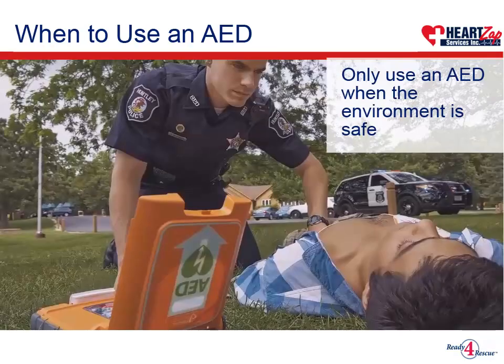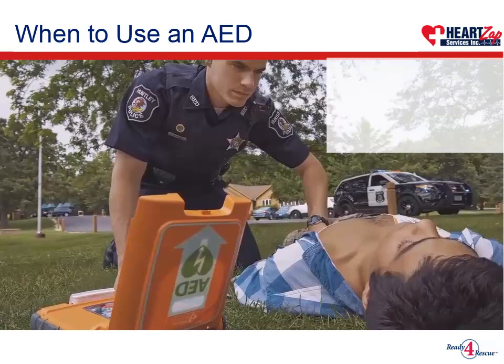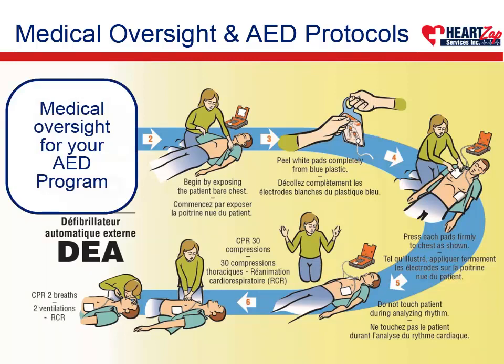You only use an AED when the environment is safe. Do not use it on a severely injured casualty, and only attach an AED on a casualty that is unresponsive and not breathing normally. HeartZap Services provides medical oversight for your AED program.